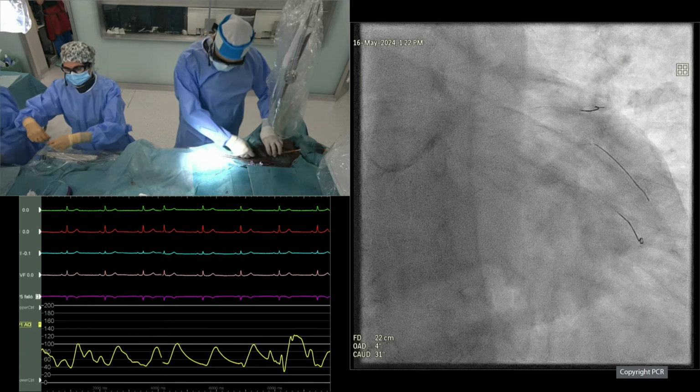Hay que sacar la otra. What do you think? La está doblada, ¿no? Esta. 60-40. So there is still motivation to kiss.